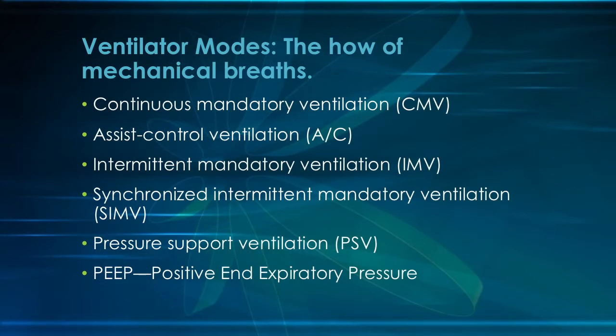All right. So ventilator modes. This is kind of the how of mechanical breaths. There are all kinds of modes. The most likely ones you are going to see out in the field are the CMV and SIMV. Continuous mandatory ventilation, or CMV, has a preset volume and rate, so your patient cannot take spontaneous breaths. The machine does everything for them.